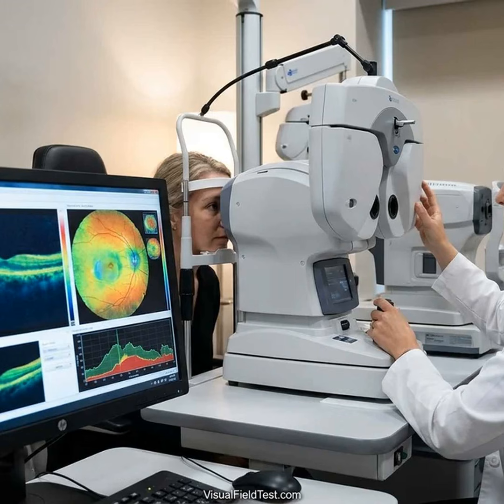Optic nerve exam. The ophthalmoscope exam looks at the optic nerve head directly. Doctors note the cup-to-disc ratio, rim color, and any nerve hemorrhages, which predict worsening. If OCT flags thinning, but the nerve still looks pink and normal on exam, the doctor may double-check the scan for error. Likewise, if the nerve looks worse but OCT doesn't show new change, potentially due to floor effect or artifact, the doctor may trust the exam more.